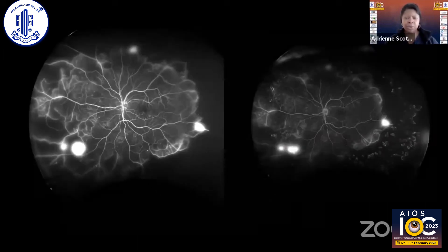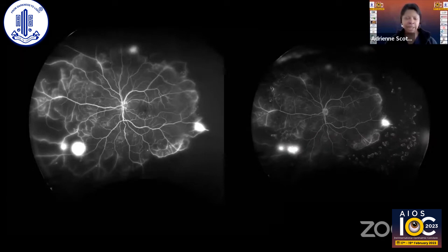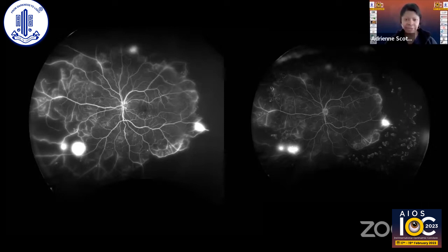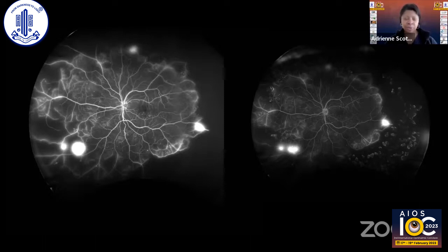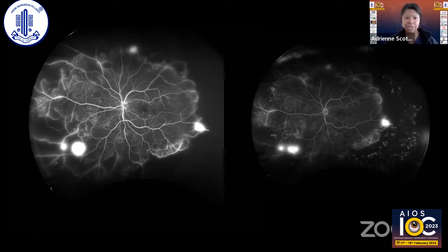I used ultra-wide field imaging to guide me, which led me to initiate treatment with panretinal photocoagulation. I used the ultra-wide field fluorescein angiogram as a guide, as I often will — it's very helpful and gauges response to treatment. Comparing pre-treatment on the left and post-treatment on the right, there was a little less leakage after placement of panretinal photocoagulation. I laser areas of non-perfusion, and it can definitely be used to illustrate response to treatment and decrease neovascularization.